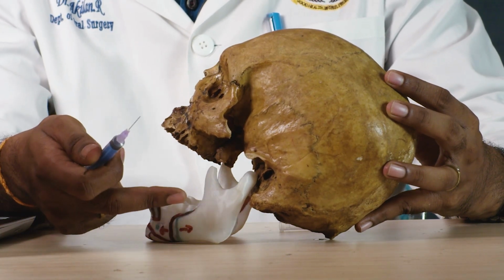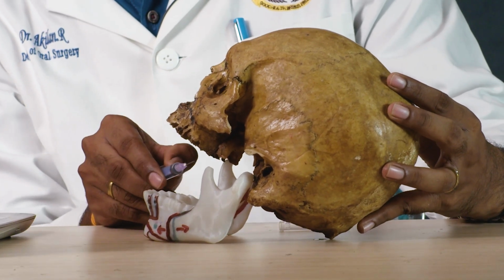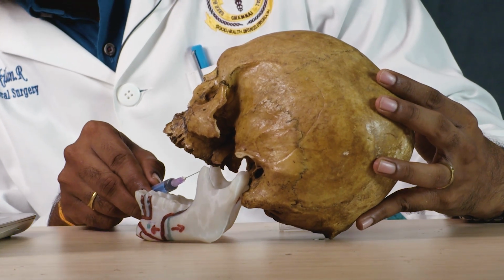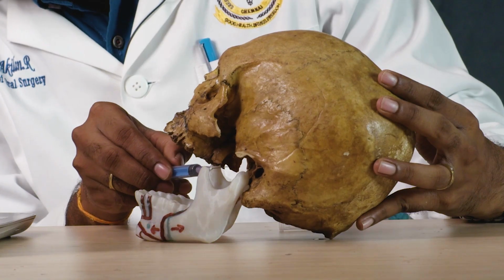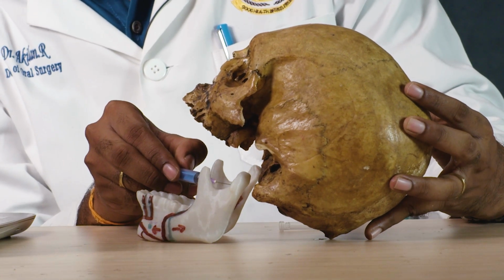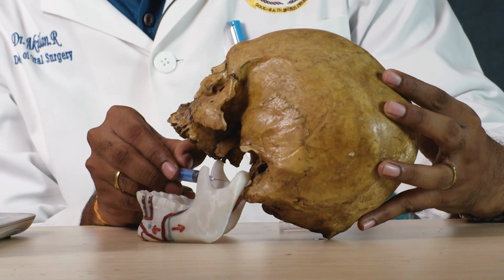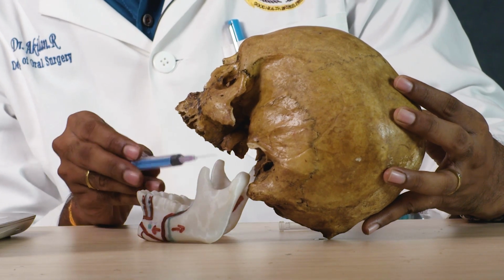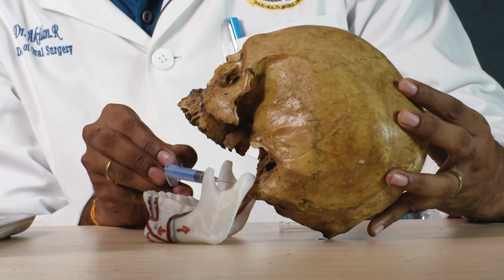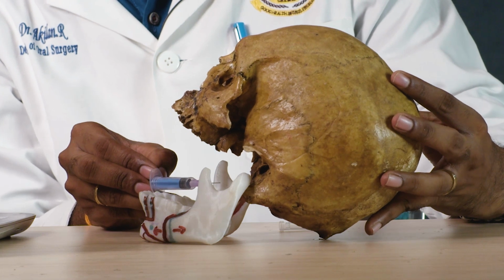So, for anesthetizing in the left side, I have to approach from the contralateral, that is right side premolar region. My needle held just below the mesiopalatal cusp of maxillary second molar and I have to proceed forward. So, as I proceed further, my needle is directed towards the head of the condyle or neck of the condyle, just lateral to the insertion of lateral pterygoid muscle. So, slightly withdraw and aspirate. Once it is negative, slowly deposit the solution of about 1.8 to 3 ml.